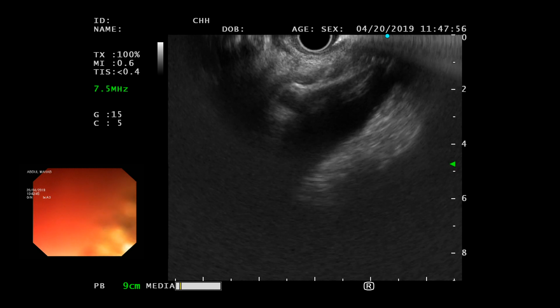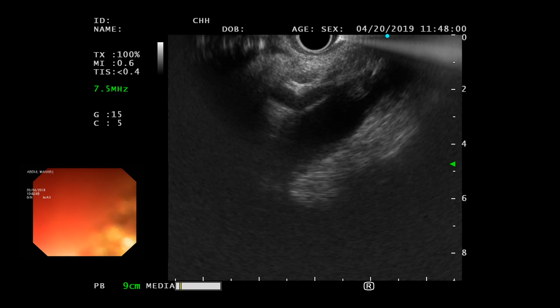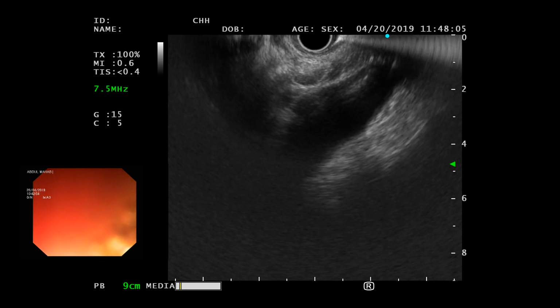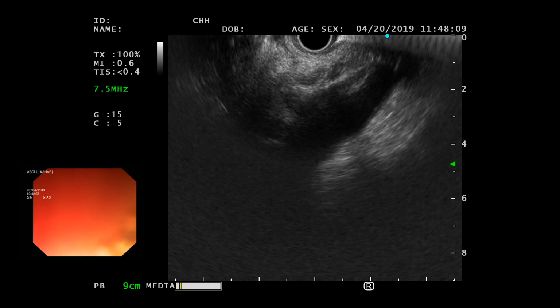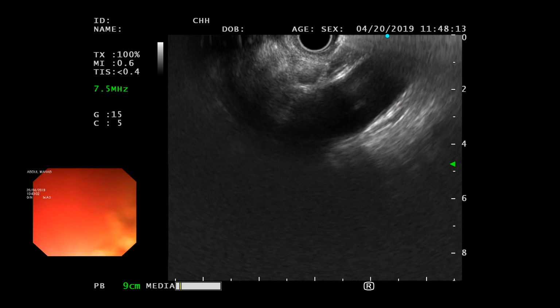Am I right? Yeah, if you inject alcohol. But for celiac block, no, even when you start injecting saline, is that right? Okay, right. So I sort of agree with you, Dr. Saad. I sometimes honestly have a hard time telling a ganglion from a node.